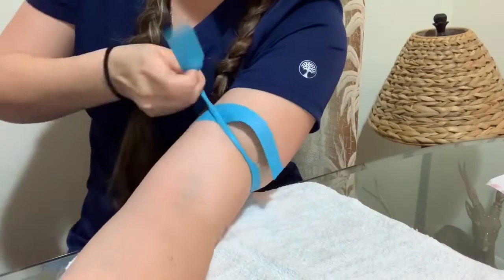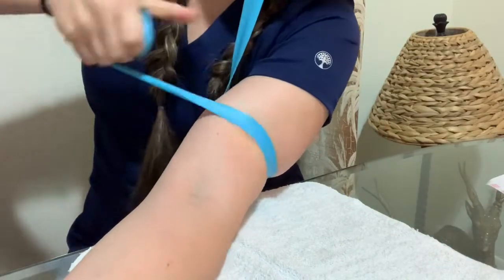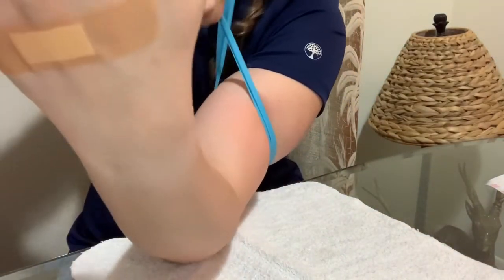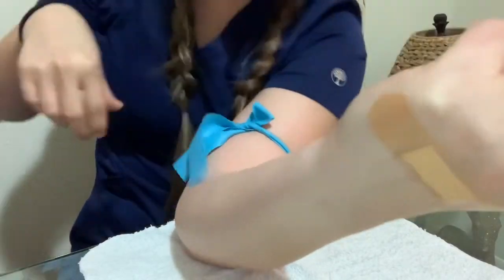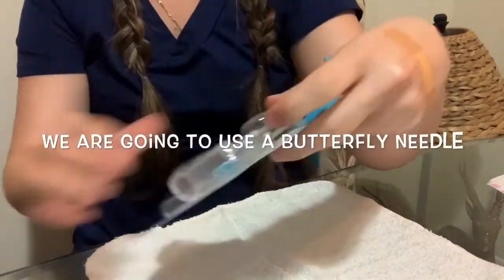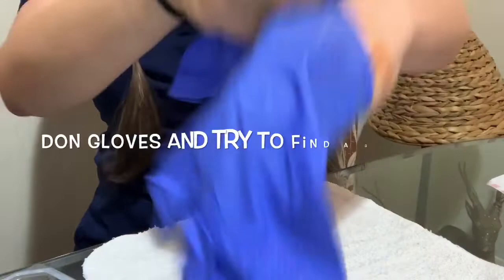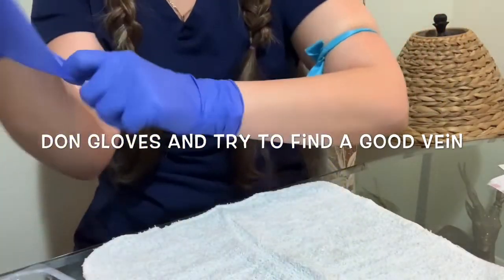I got a little excited and I want to do something extra for you guys. I'm gonna show you how I do a blood draw. Before I became a nurse I was a nursing assistant at the hospital for about two years, and I used to draw blood a lot — that's why I decided to add this part to the video.